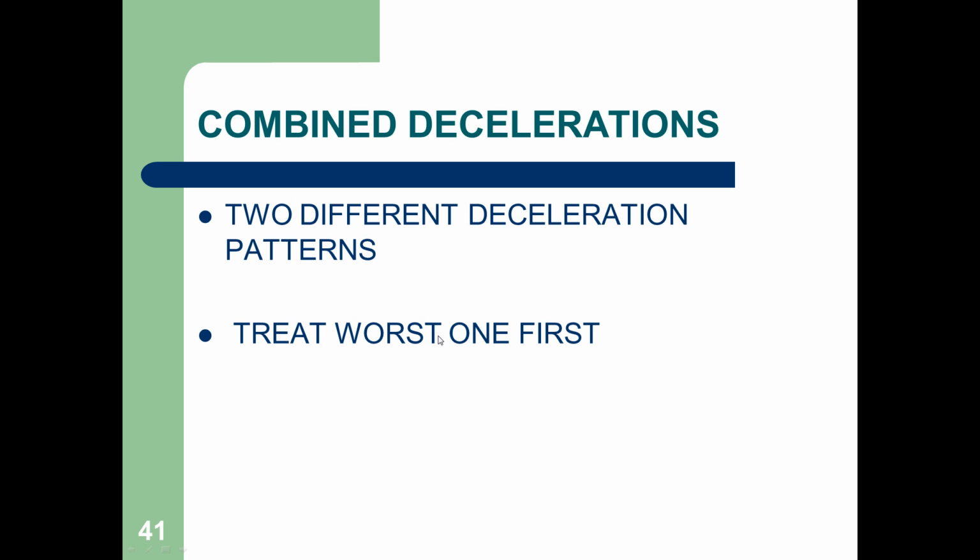You treat the worst one first. Okay. So if it's a late decel, you may have to certainly change their position, stop the pit, IV, but you treat the worst one first. Okay. All in all, the best rule of thumb is, again, do what's easiest first, change their position.